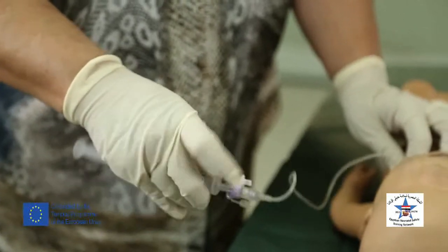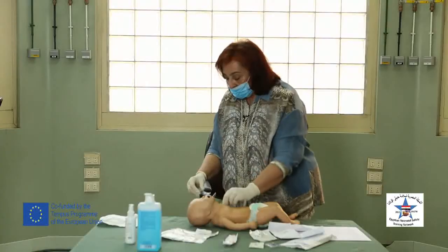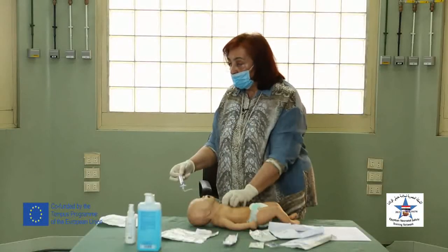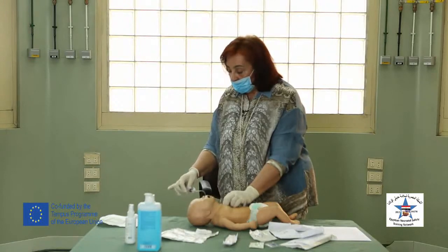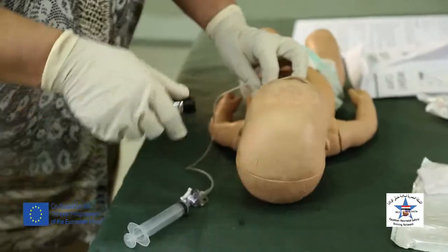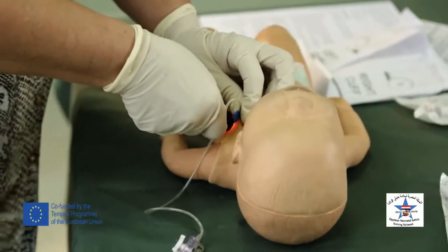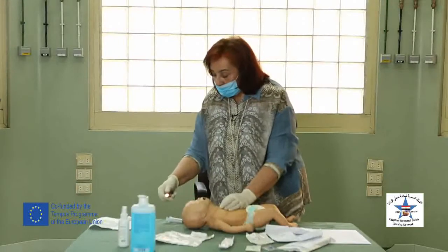I will redirect again and push the air outside, and so on until I find resistance to the withdrawal of air through the butterfly needle. I will stop, repeat my transillumination again to see that the air has been emptied from the pleural space, and the transillumination test now is negative.